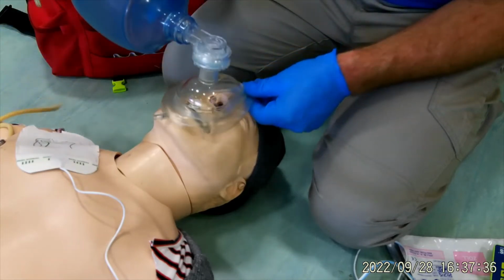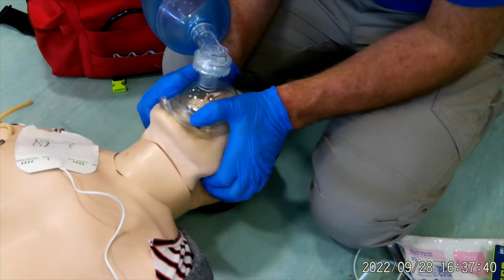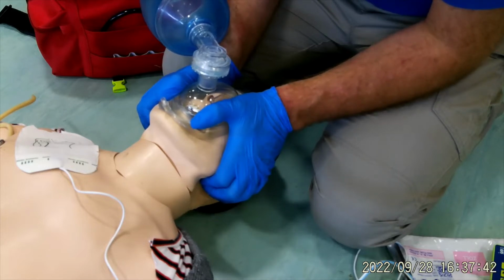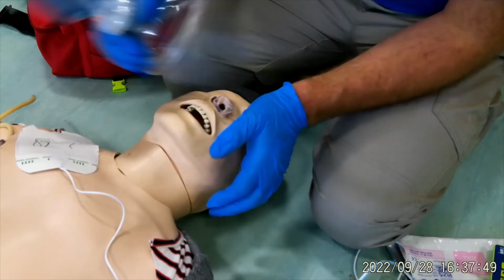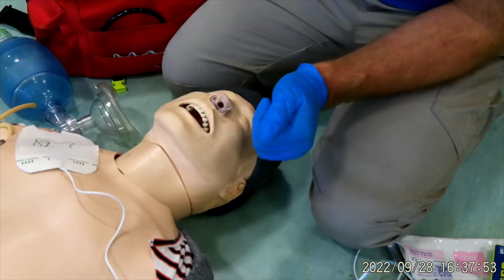I could then bring this back on, and then my colleague could do 2 more ventilations. So the aim is I get the nasopharyngeal on whilst they're doing their 30 compressions, which is roughly 18 seconds. If I wasn't happy with that, I could then go up to an oropharyngeal airway.